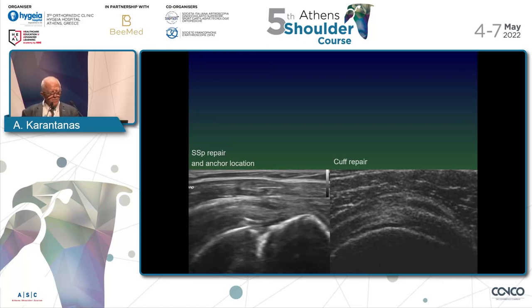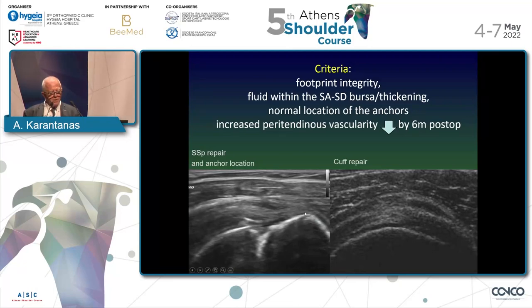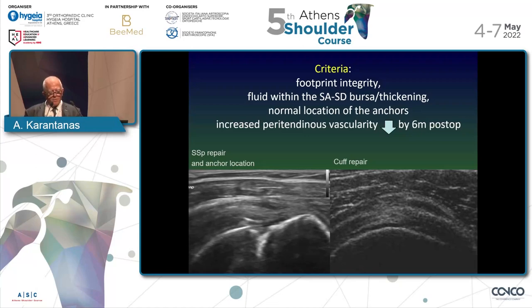Here are two examples of supraspinatus repair — we see the suture material. The next issue to address is footprint integrity. You see the footprint of the supraspinatus tendon with a beak-like appearance. We have fluid within the subacromial subdeltoid bursa, this hypoechoic area, and sometimes this is also thickened. We have loculation of the bursal fluid — a thickened bursa with some debris inside.